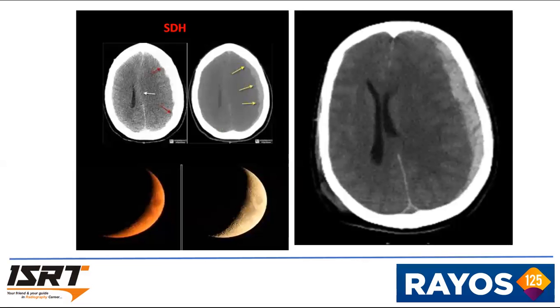So it's a collection of blood below the inner layer of dura mater, external to the arachnoid membrane. It is the most common type of traumatic brain injury. The source of bleeding is from the bridging veins that cross the subdural space. The appearance is a crescent shape in the CT image.